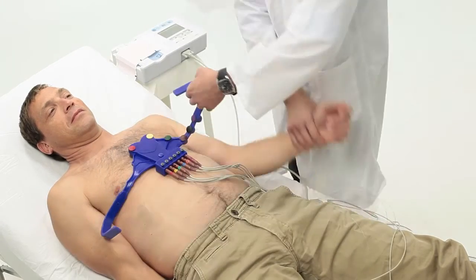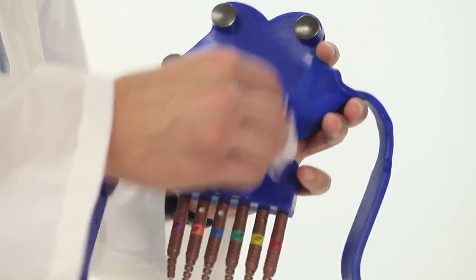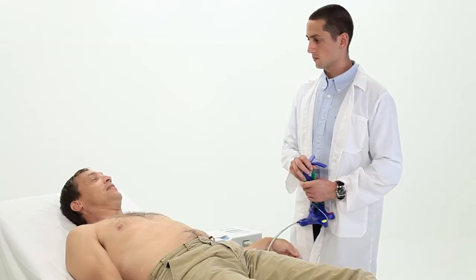Once the reading is obtained, you can easily remove the belt and clean it with LevMed disinfection wipes. That's it! The next patient ECG assessment can begin.